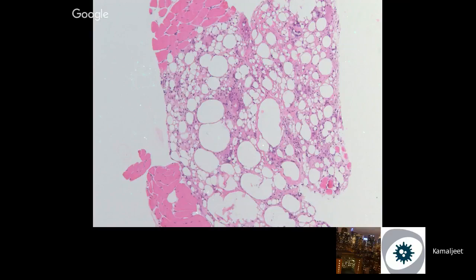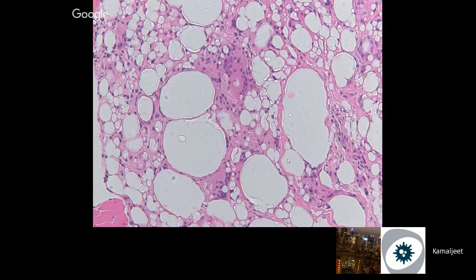So basically what it looks like is you have skeletal muscle and you have these variable size round spaces, which look like lipocytes, adipocytes, or lipoblasts. And there might be giant cells and histiocytes. So the key is you flip your condenser and the things will look refractile. So that's the implant material. The giant cells can have asteroid bodies in this.